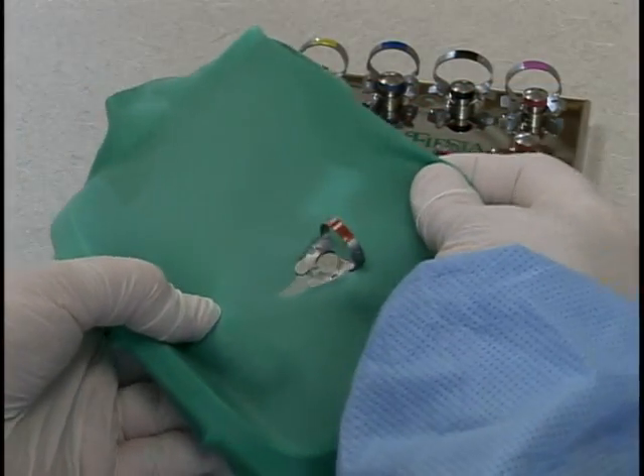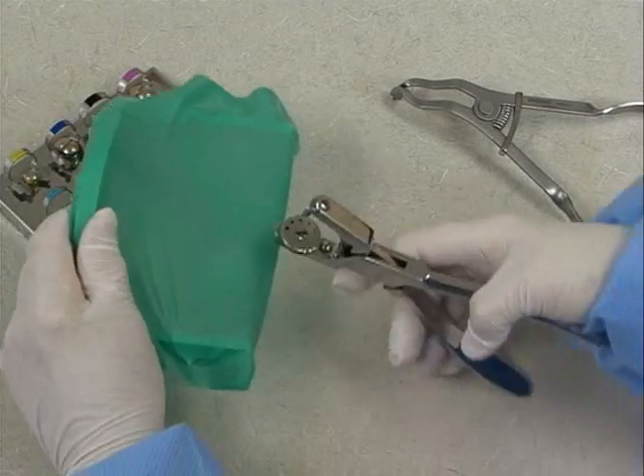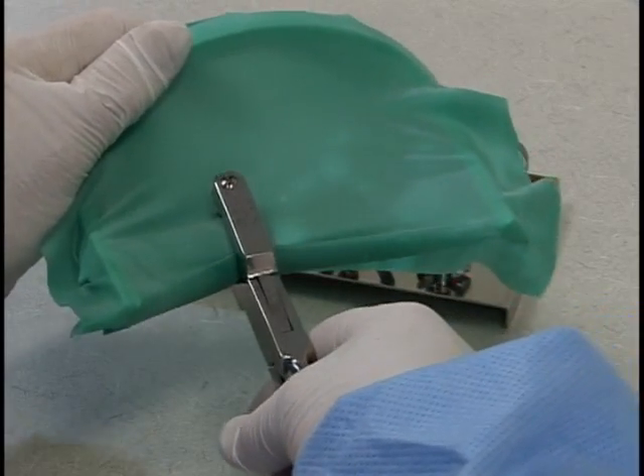The most appropriate option in this case is the three-hole technique. Dam placement is easily accomplished with a general field three-hole option.